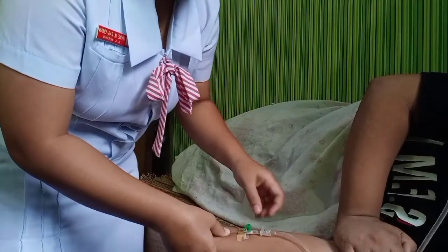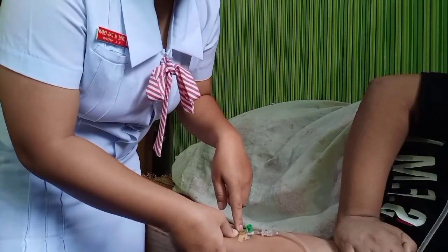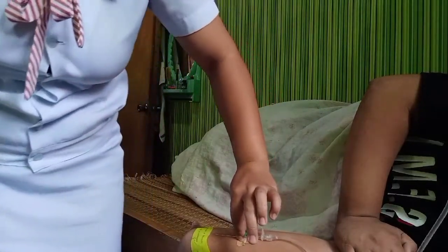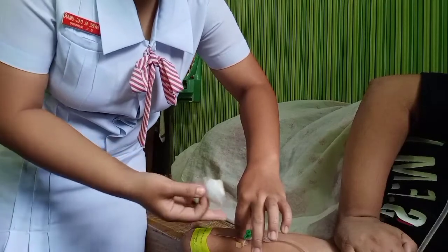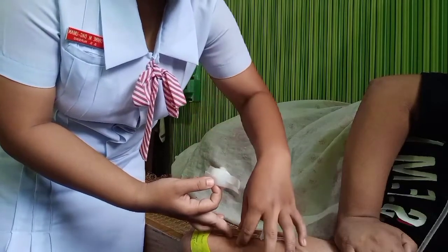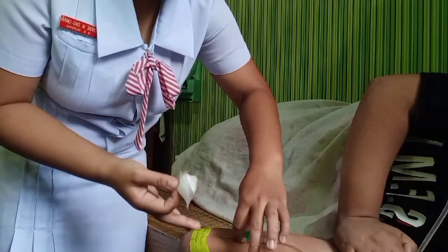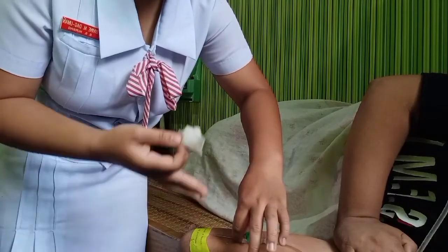For the last plaster, which is in the area of the butterfly of the cannula, we need to hold it for a while, and then get the dry cotton balls with the plaster also, and detach slightly. We are not going to detach right away because there might be a burst of blood from the vein or the site of injection.